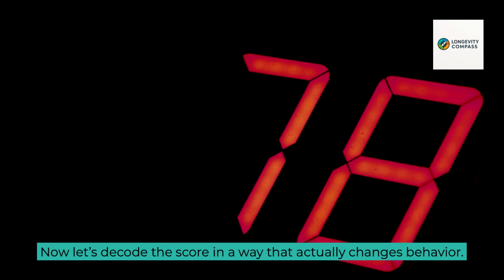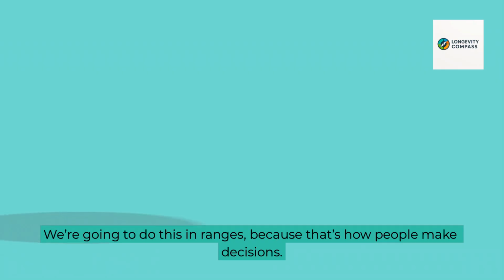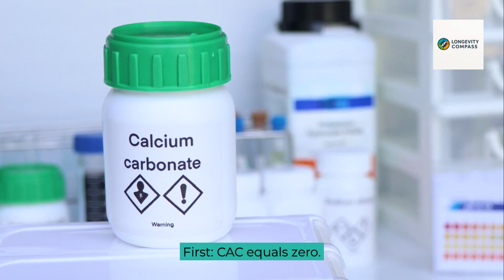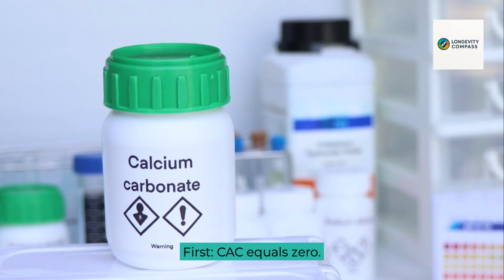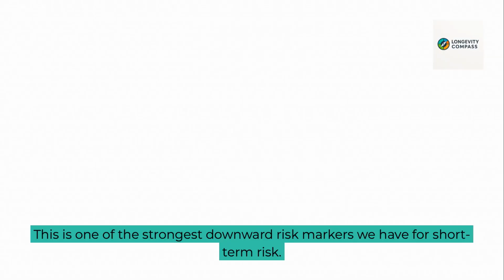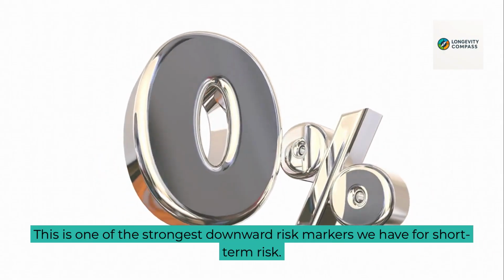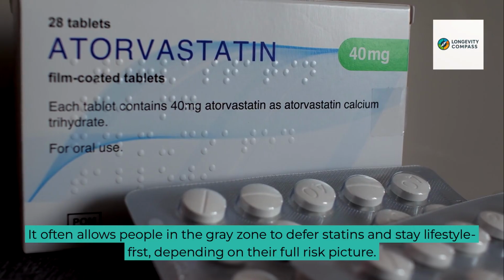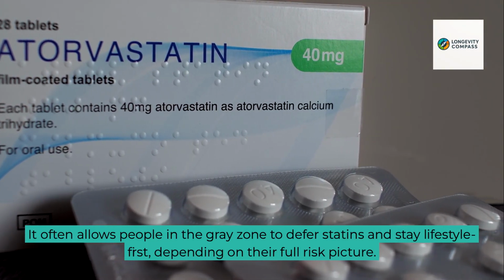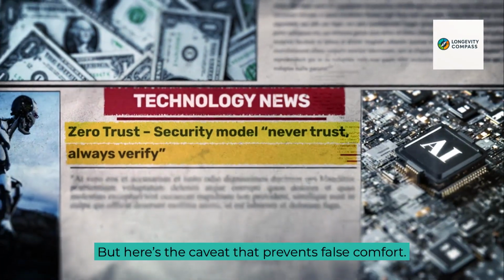Now let's decode the score in a way that actually changes behavior. We're going to do this in ranges, because that's how people make decisions. First, CAC equals 0. This means no detectable calcified plaque. This is one of the strongest downward risk markers we have for short-term risk. It often allows people in the gray zone to defer statins and stay lifestyle first, depending on their full risk picture.